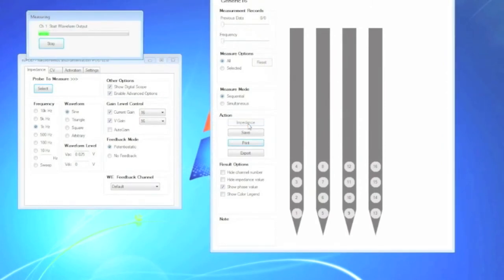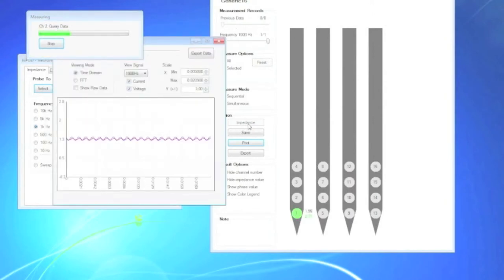As it runs, impedances and phases will be shown on the screen next to the site. The digital O-scope will show the relevant waveforms. Note that your measurements may look different.